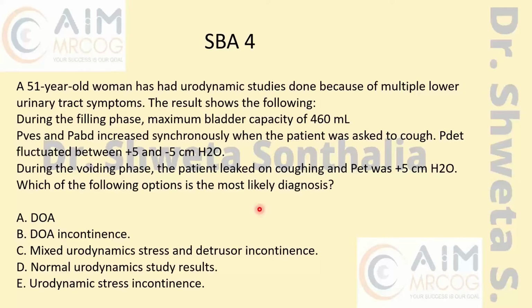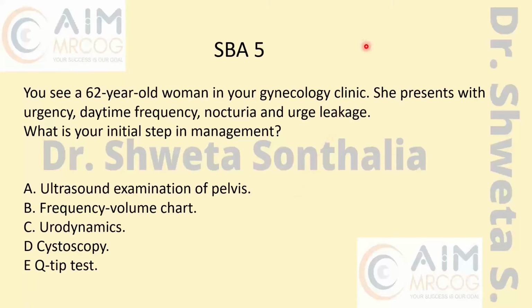Very good, my dear. See how easy it is, because they have again and again mentioned to you that detrusor is normal. So there is no detrusor problem, forget about this. No mixed, because detrusor is normal. No normal, because there is leak. So the answer is urodynamic stress incontinence. Dr. Shazia, do you think after attending the lecture it is easier for you? Yes, it is understandable. Good. Is the answer E.